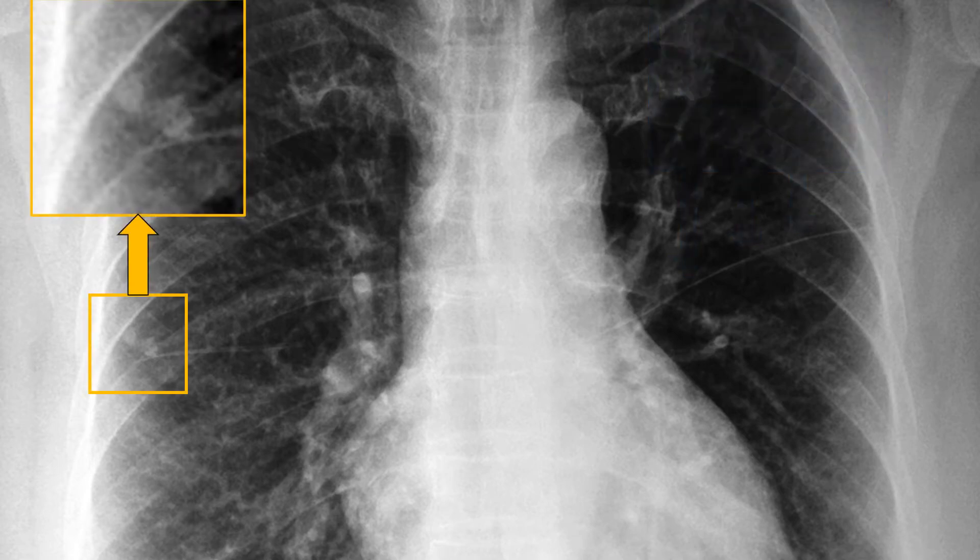Also, there are two well-defined nodular opacities in the right mid-zone, adjacent to and above the right horizontal fissure, probably calcified granulomas.